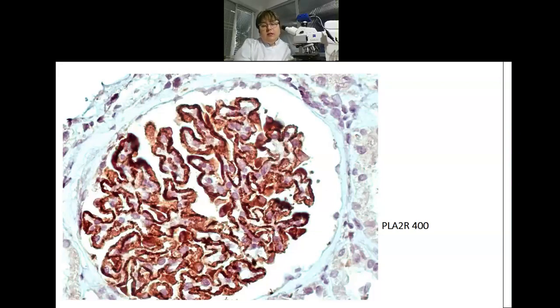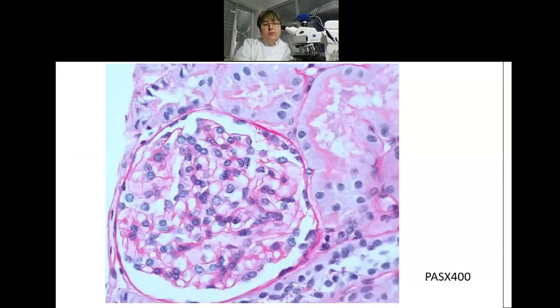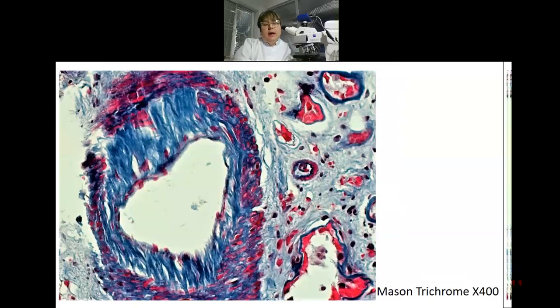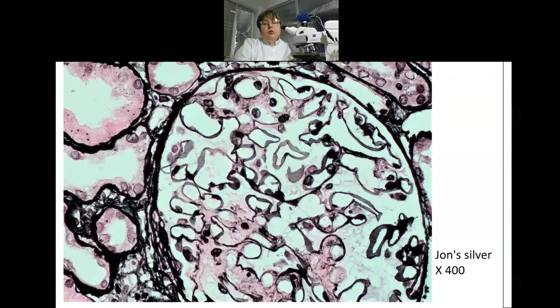For light microscopy study, we also use hematoxylin-eosin as well as special stains. In this photo, you can see periodic acid-Schiff stain on paraffin sections. We can evaluate basement membranes in mesangial areas and mesangial cellularity by this stain. We also evaluate the presence of endo- and extracapillary proliferation through this Jones silver stain.